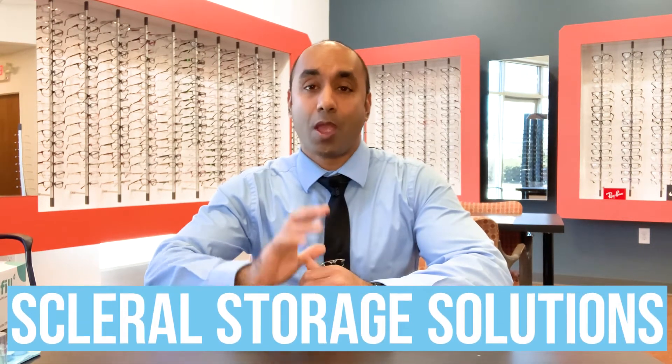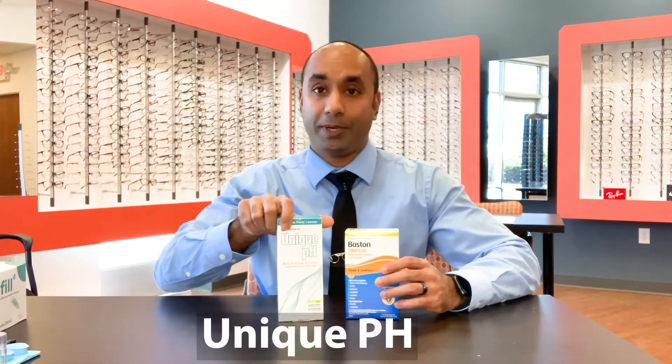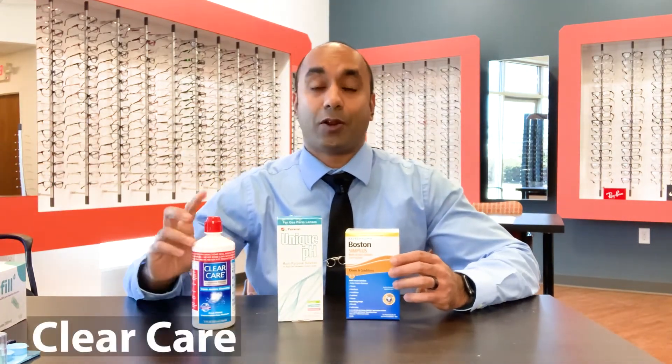Hi everyone, Dr. Lilly here. Today we're talking scleral lenses — specifically storage solutions. When it comes to storing your scleral lenses, there are three solutions that we recommend: Boston Simplus, Unique pH, or Clear Care.